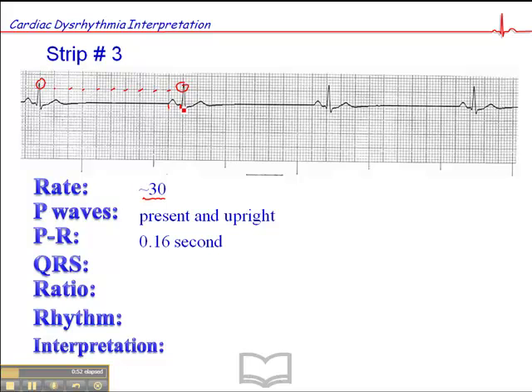The QRS begins at about a millimeter off the dark line there. That's four small squares multiplied by 0.04. That's 0.16 second.